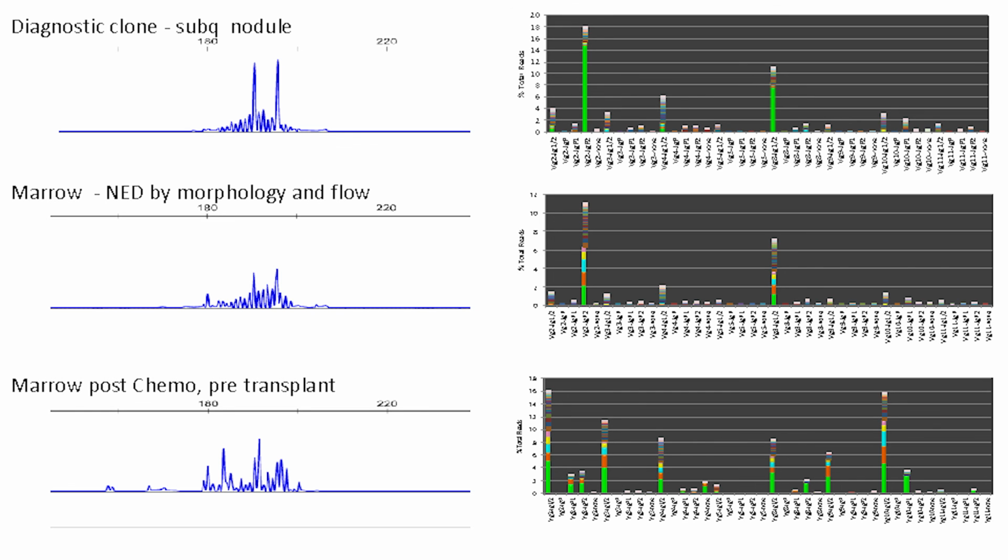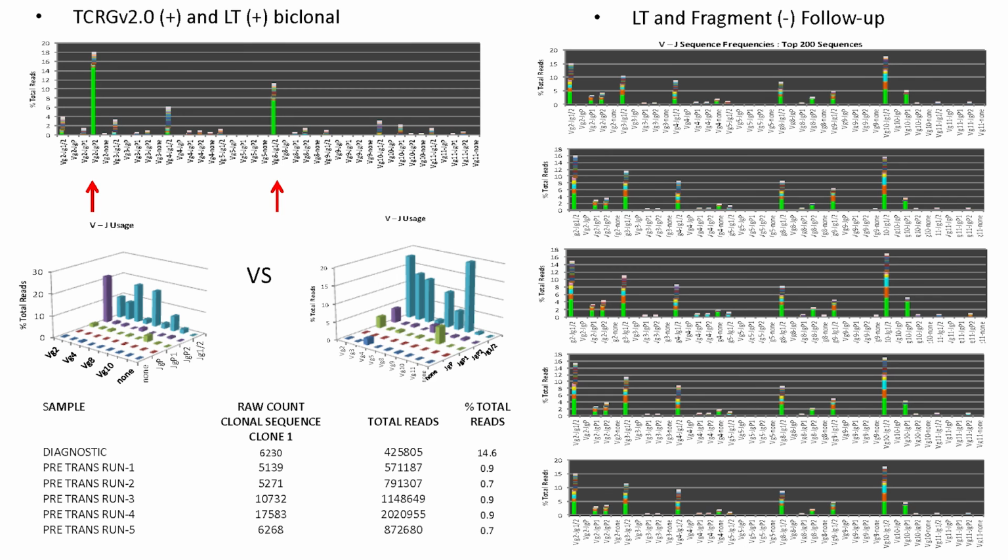Post-chemo, this patient, now pre-transplant, well, what do you do with this patient? Do you transplant this patient or not? Does this patient have any type of residual disease? And clearly, with the current assays by fragment analysis and flow, you cannot do it. But with the NGS assay, we know that that clone is actually there when you look for the specific sequence.